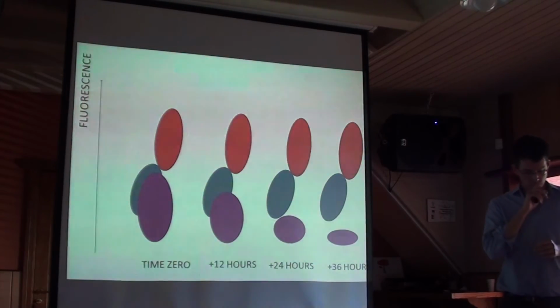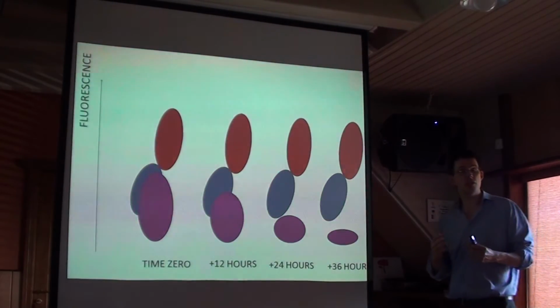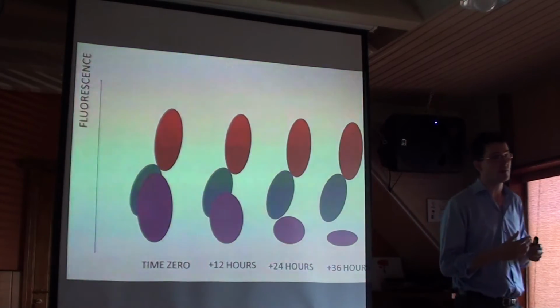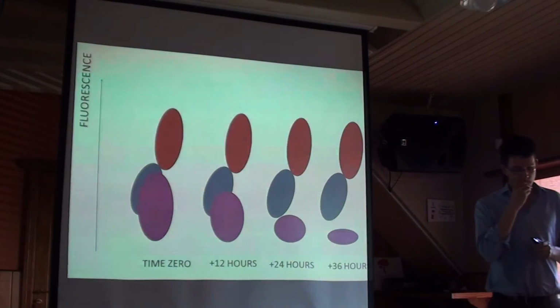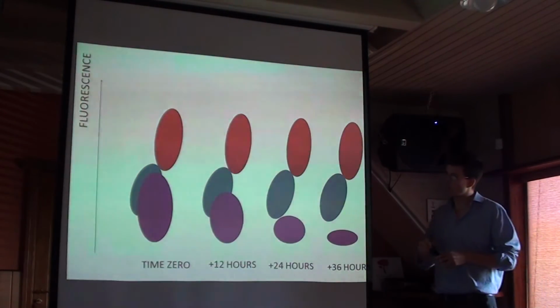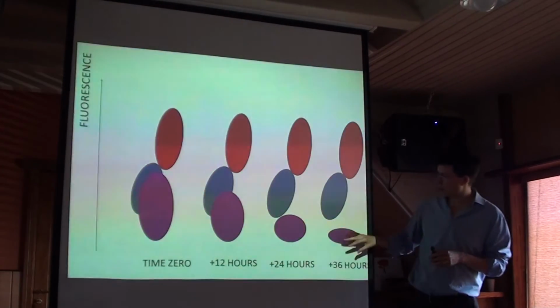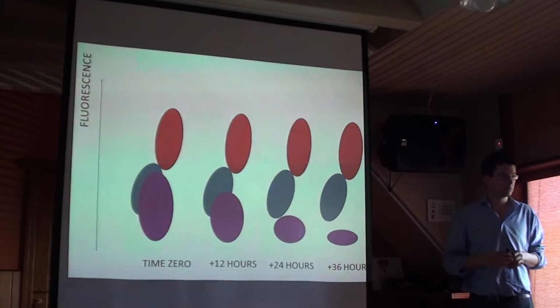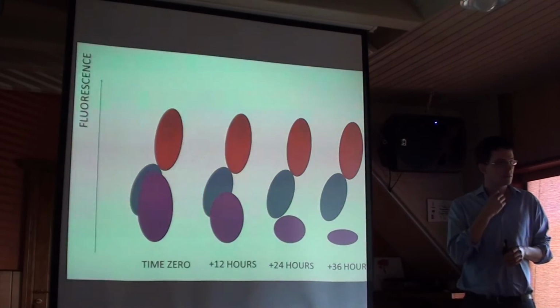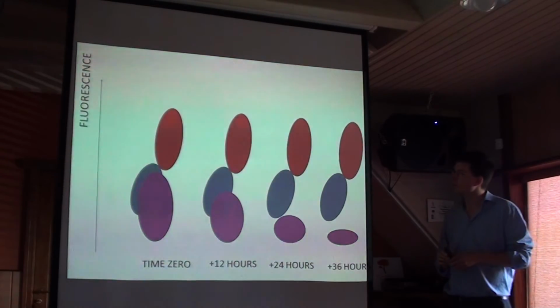So I liken these young neutrophils to child soldiers that are being used in a time of crisis. So here we are using lots of child soldiers. Here, no. In the first sample there are very many young neutrophils, and 36 hours later there are practically none.